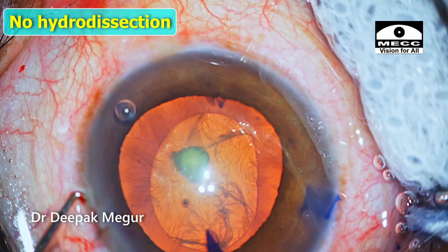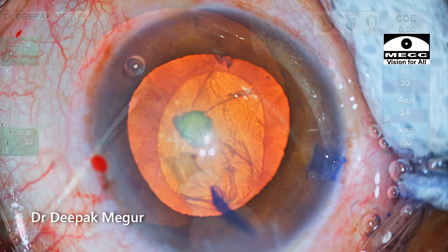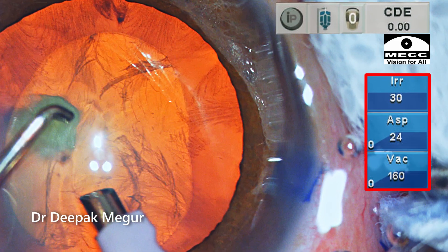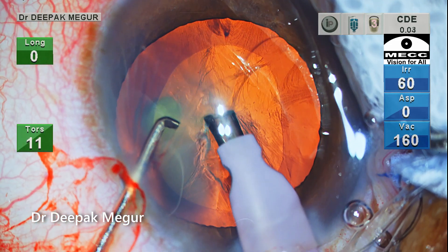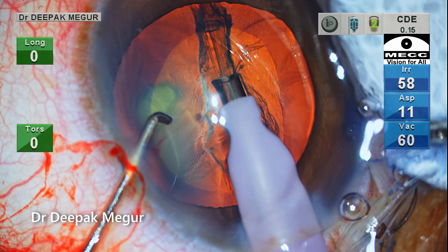No hydrodissection and no nucleus rotation. Please note the parameters before I start. I set the bottle height at 30 centimeters and correspondingly low flow rate and vacuum. The plan is to create a trench and then continue with the stop-and-chop technique.